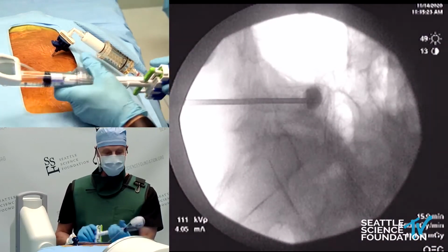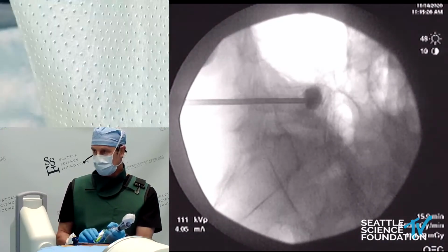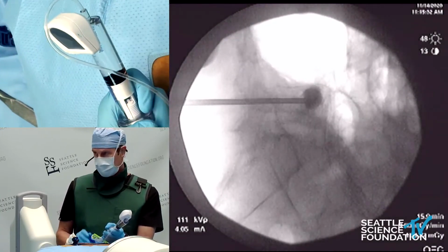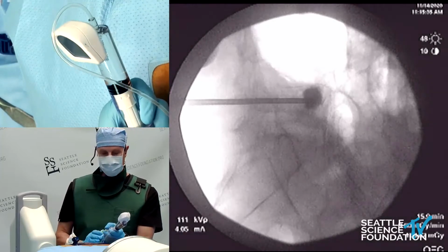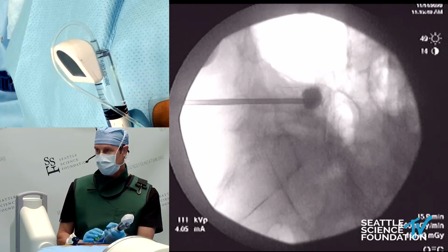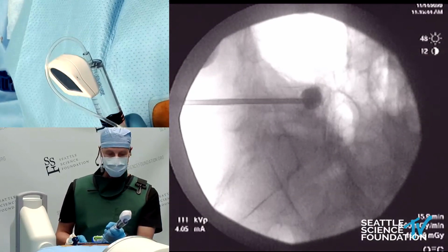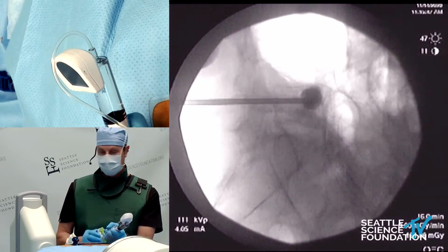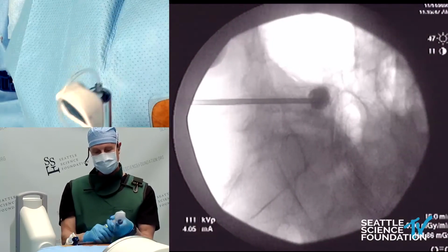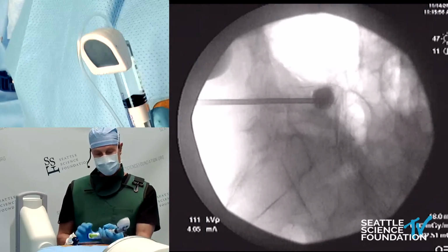We want to fill the void created by the balloon. We also want to fill into the interstices of the bone. One of the common mistakes that we see people make is that you just fill the cavity created by the balloon and not the interstices of the bone. So it has to go into the cavity created, also locking into the medullary or cancellous bone that surrounds the balloon cavity. And so the pressures on this are in the range of about 30 to 50 psi and dropping quickly, which is perfect.